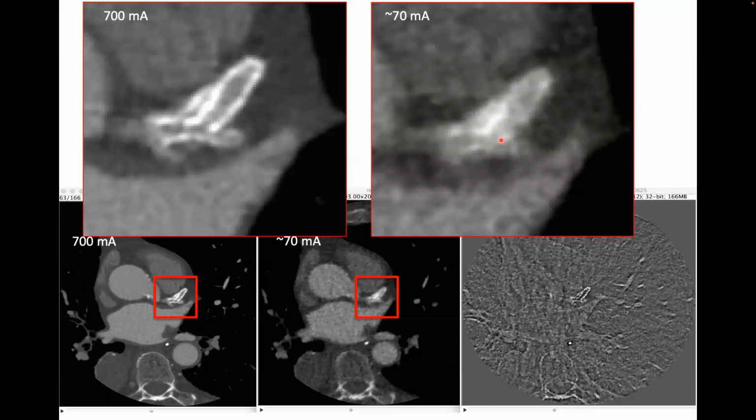You can program that robot to move that C-arm through arbitrary angles. So in the example I just gave, you could get the C-arm to go around a patient who's lying on a table, right? And that is a product. That's called cone beam CT. That's pretty cool.